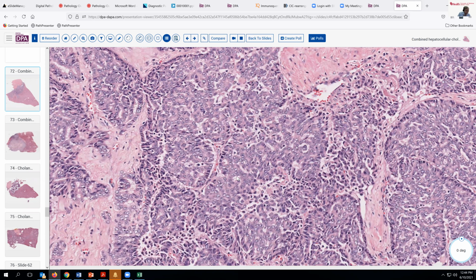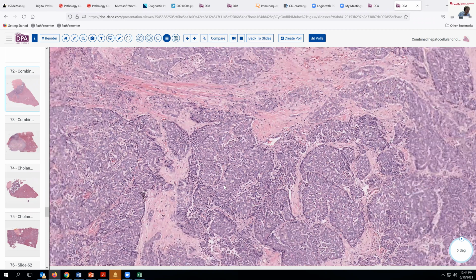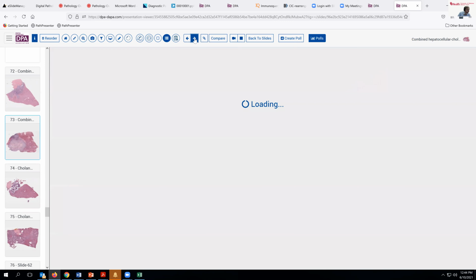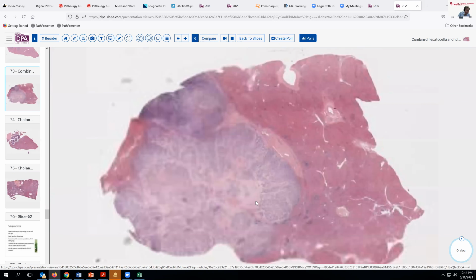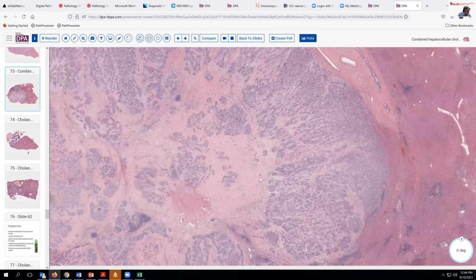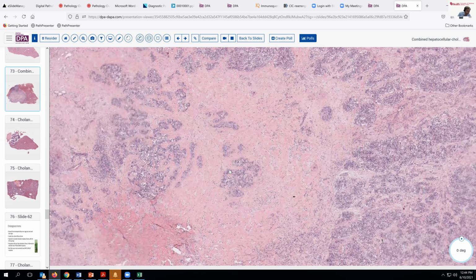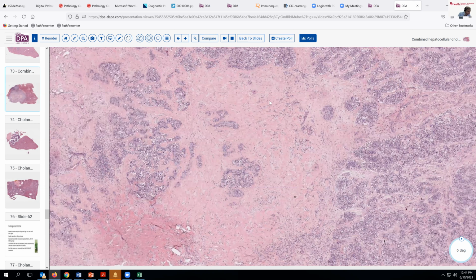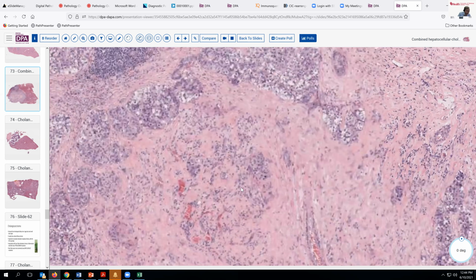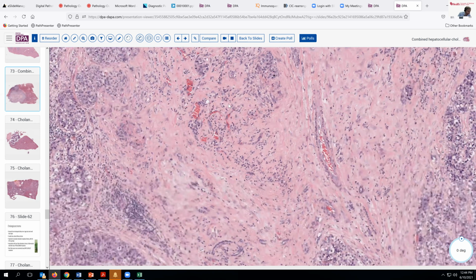So you could say, well, this could be a hepatocellular carcinoma. So that's part of one of the ways that this lesion can present. Another variant on this, maybe less obvious, here, in this case, a nodular area, clear, solid areas, but a few areas show a little bit more glandular differentiation and pattern.